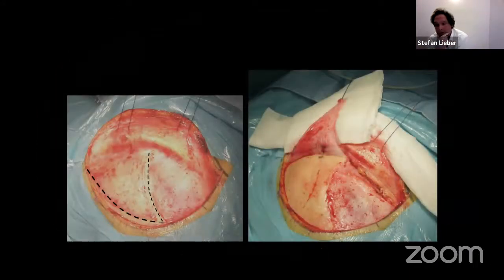This is the only surgical or intraoperative picture of my talk, just to illustrate the necessity of soft tissues for all these approaches. So this is the harvest of the pericranium on this side. This is a right-sided exposure. This is pericranium. This is temporalis muscle. Obviously, this is the galea, which has been retracted. And that's the technique we're using here in Paris, doing a lot of skull base, preserving tissues, and also harvesting tissue for closure of defects, avoiding non-autologous material.